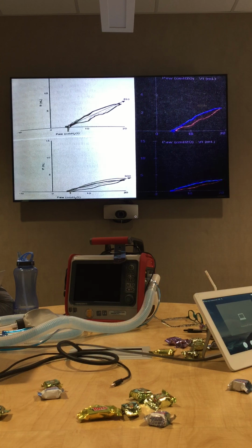So just for example, this patient here was given a bronchodilator. It increased their lung volume by 150 cc's. They went from, as you can see in this picture, 308 cc's to 458. It also took less pressure to ventilate them. If you look at the lower slide, my peak inspiratory pressure is past 20. If you look at the top, it's about 19. So not only did I improve their compliance, but I also allowed their airway to be a little bit less resistant.